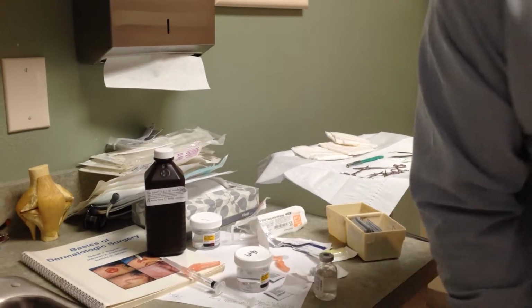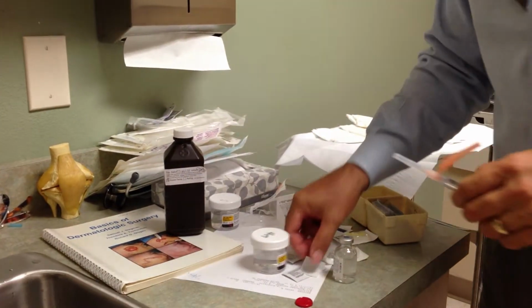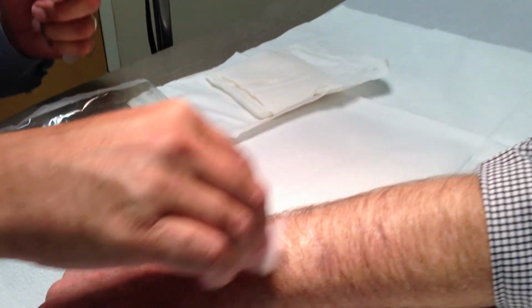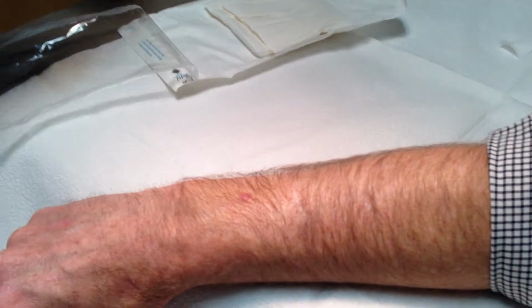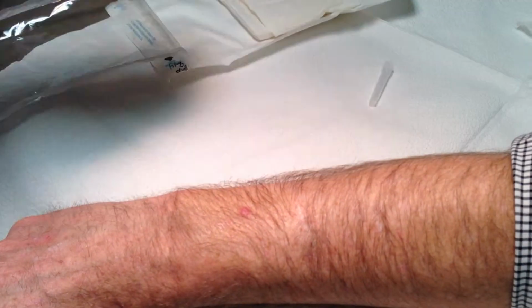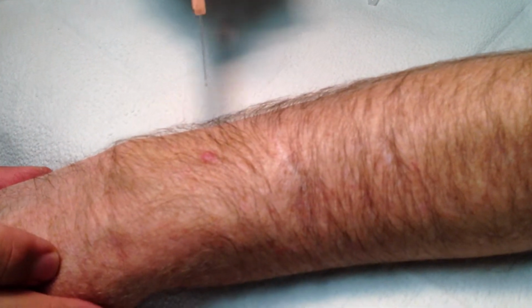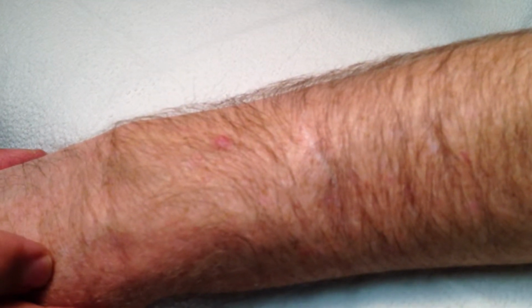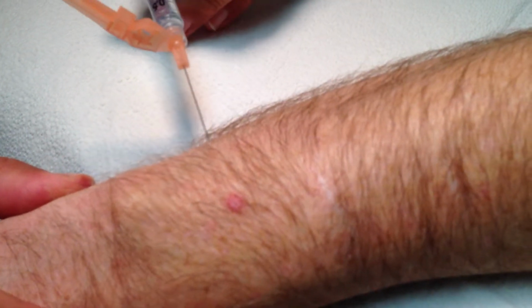So now I'm going to give him a local anesthetic so that he doesn't feel the rest of the procedure. This is a little alcohol swab, and that alcohol isn't quite as good as betadine, but it gets the job done for when you're just sticking a sterile needle under the skin. If you see this lesion right here, it's pink and scaly, you're not going to be excising anything, but I'm just showing you for demonstration purposes.